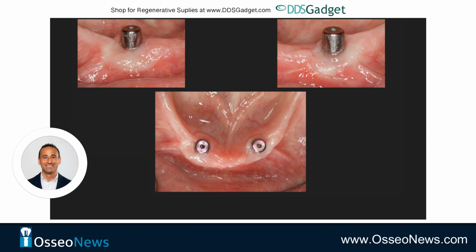8 weeks later, and we can see that we had successful take of the grafts. Bottom picture shows you that we have keratinized tissue 360 degrees around. And I think that had we initially just split whatever keratinized tissue was there and not done the free gingival graft, I think we would have ended up with no keratinized tissue at all.